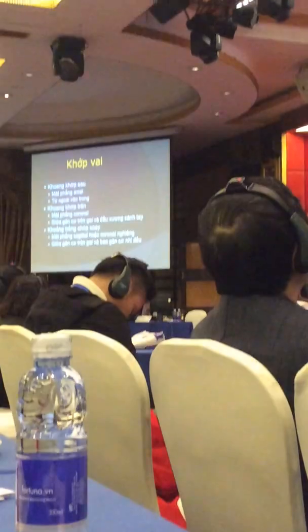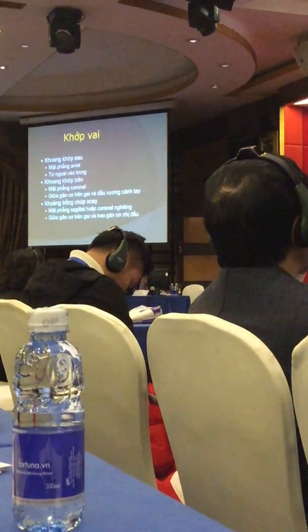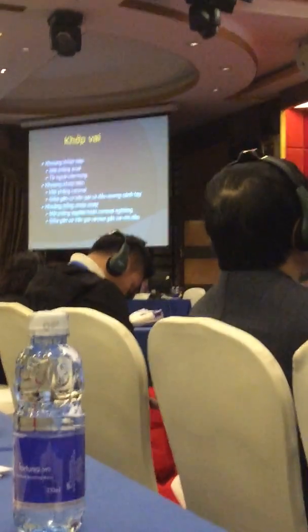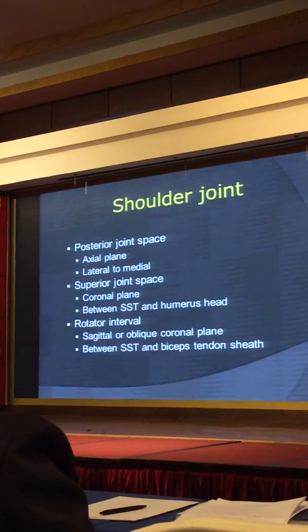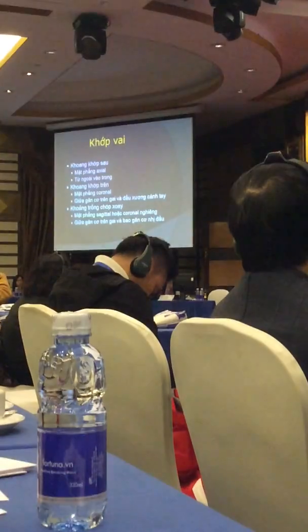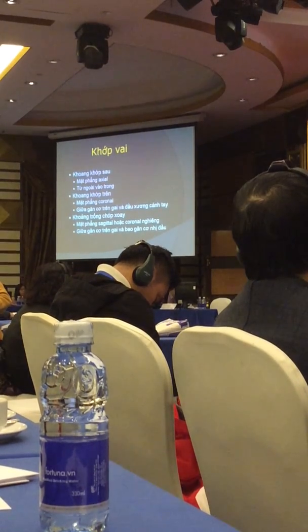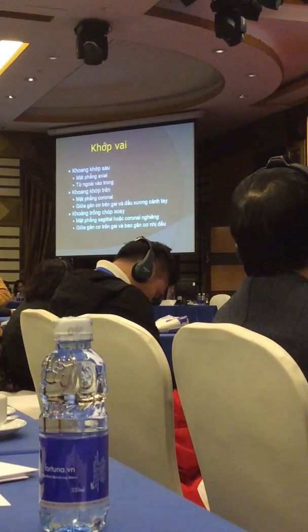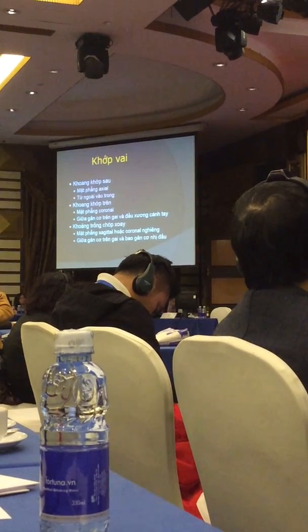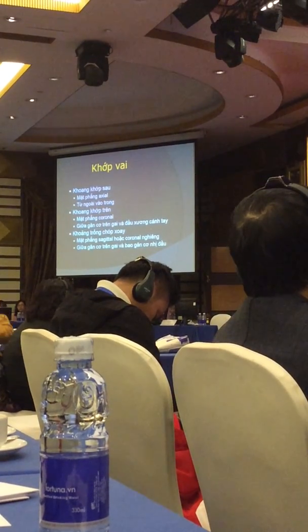So for the shoulder joint, you can use the posterior approach, lateral to medially along the axial plane. For the superior joint space, you should use the coronal plane approach. And for rotator intervals, you can use sagittal or oblique coronal plane approach. It's necessary to know the normal anatomy, of course, to do proper ultrasound-guided interventions.